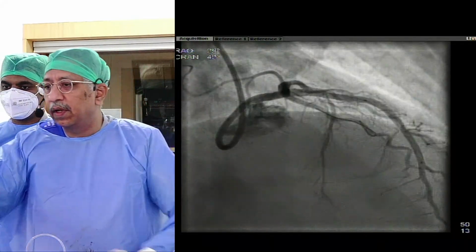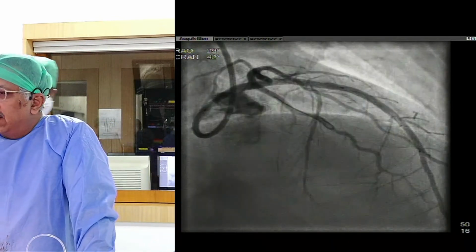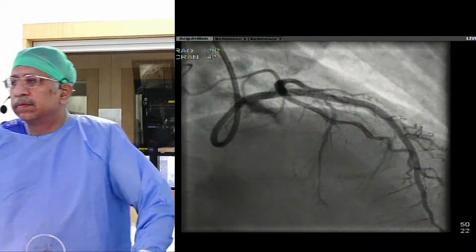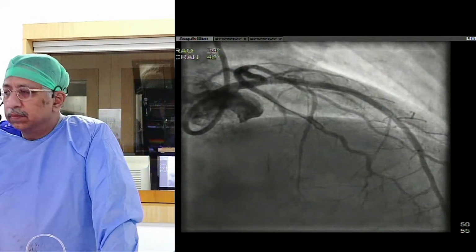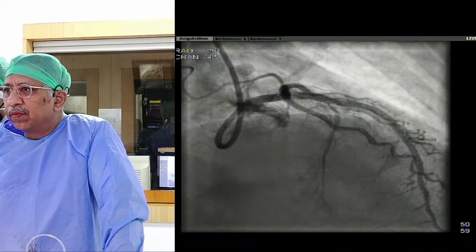Next morning, the cath lab is much better here. And again, you can see the stuff in the coronaries, very ugly looking, a thrombus-containing region in the left anterior descending. So here's a patient who we treated medically, is stable now, the flows are good.